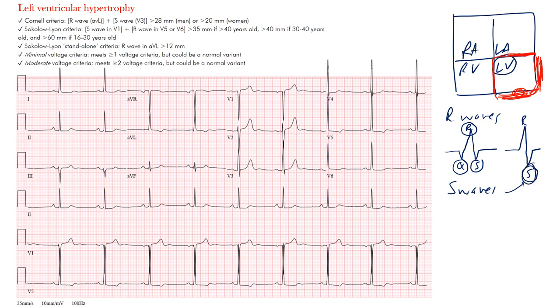There's the Cornell criteria, the Sokolow-Lyon criteria, and a standalone criteria, among many others. The Cornell criteria looks at the R wave in AVL plus the S wave in V3, and it is gender-specific. In men, if it's at least 28 millimeters in amplitude that meets criteria; in women, over 20 millimeters meets criteria. Looking at lead AVL, the amplitude appears to be about 12 millimeters.